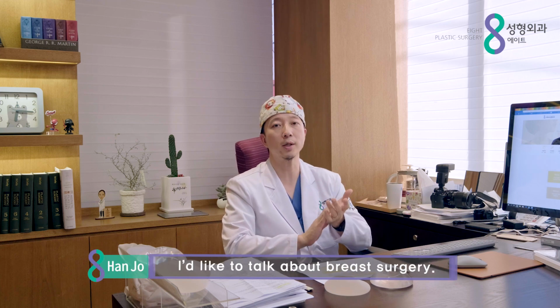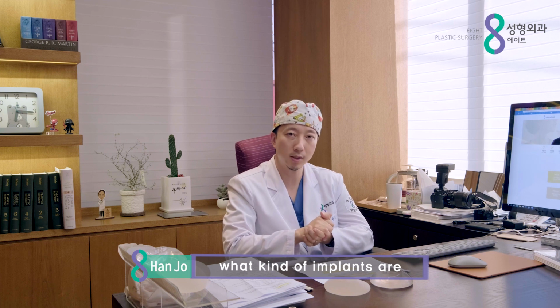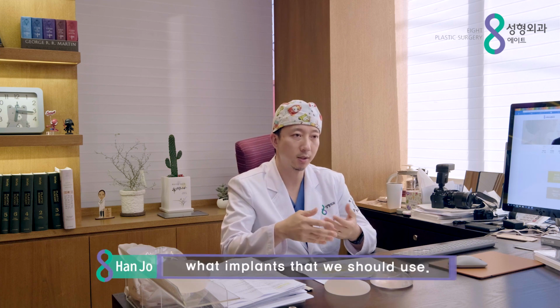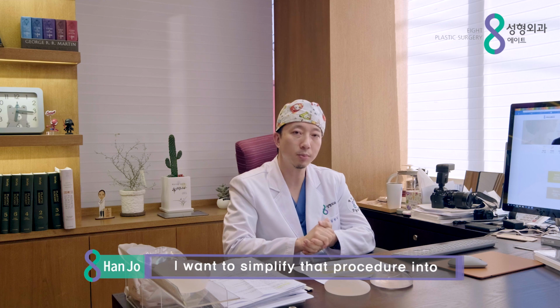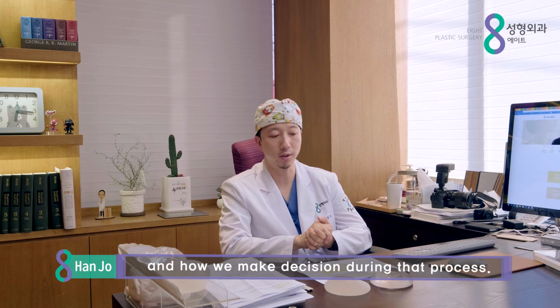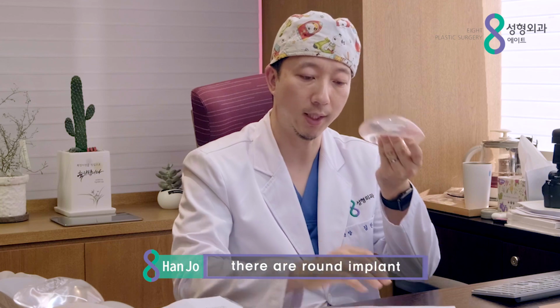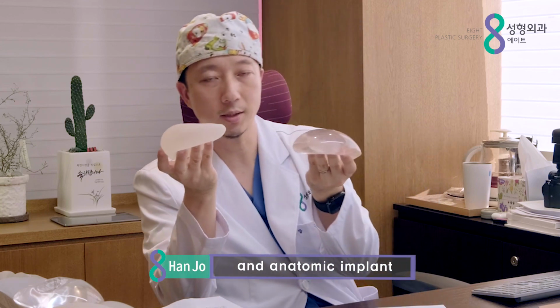I'd like to talk about breast surgery. There's so much confusion over what kind of implants there are and what implants that we should use. And I want to simplify that procedure into what kind of implants there are and how to make decisions during this process. So first of all, shape-wise, there are round implants and there are anatomic implants.